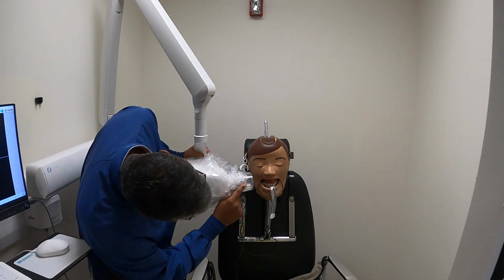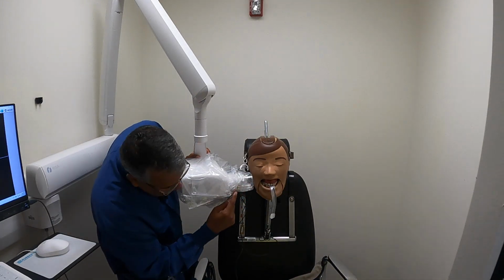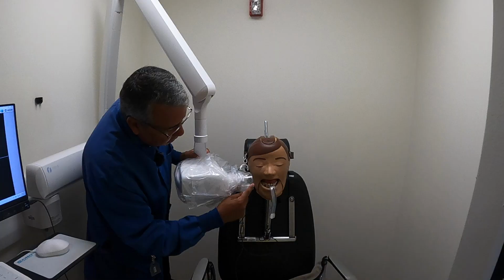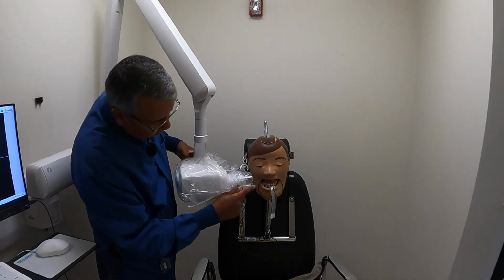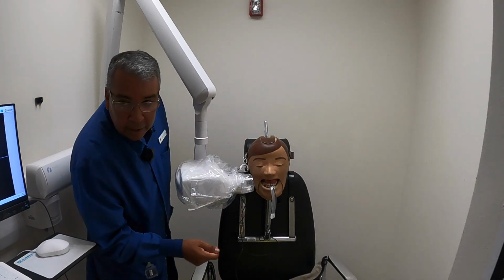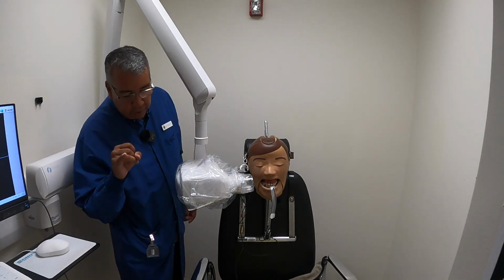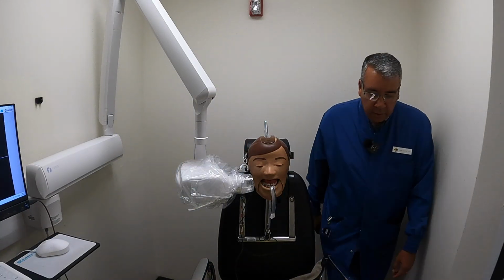Not too high, not too low, the side of this. Now you guys tell me from your angle right there, and you kind of want to crouch down just a little bit to see that. Am I too high or am I too low? Too high. I'm too high. So I need to take this and bring it down to where it is right by that bite. Vertical, horizontal, cover the film. We just did all those things right there, and then I'm going to go ahead and go back to here.